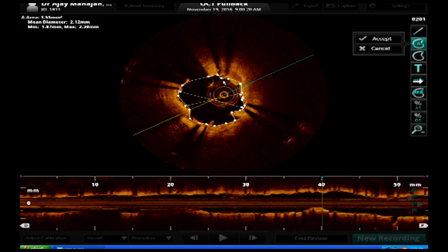If it's a male patient, we know from many IVUS studies that the proximal LAD will be around 4 millimeters. The problem with this type of stent and its length, which we have also discovered in our hospital in Krakow, is that if you go for a bigger distal diameter, you will cause a dissection pretty sure with a 3.0 distal diameter. But in this case, you could go up, surely, to 3.5. The question is, can we go further to 3.75 or maybe 4?